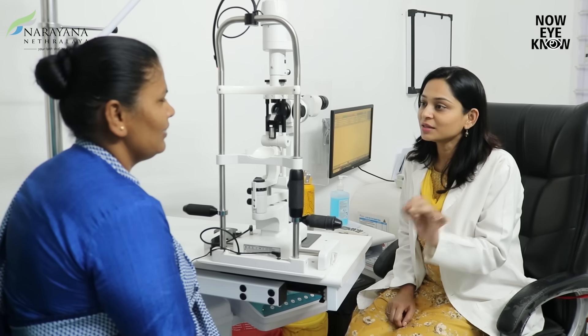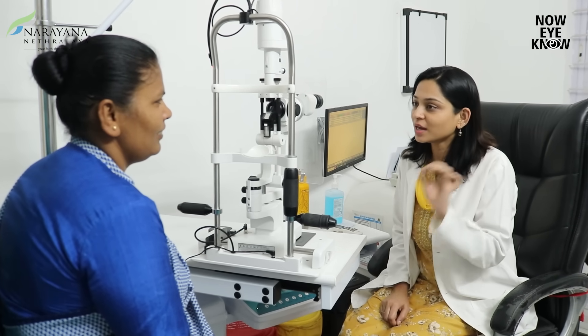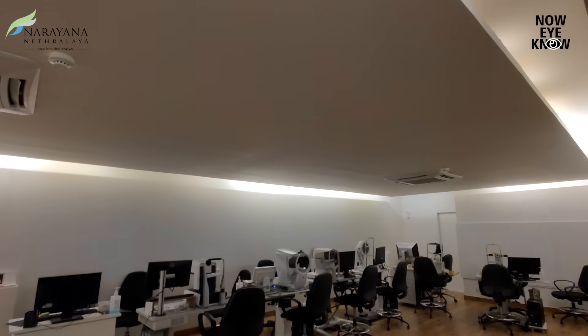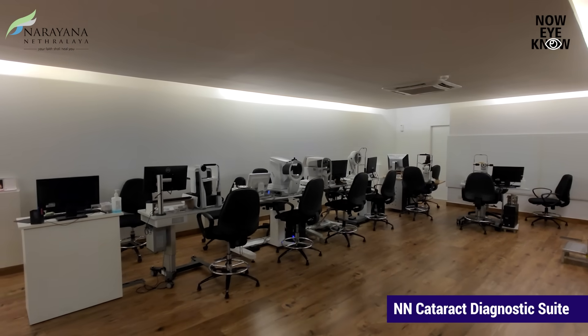We believe in giving you personalized care because every eye is unique and different. We do a comprehensive assessment of the entire eye to make sure we give you a perfect post-operative visual recovery. We have a dedicated room here — our NN Diagnostics — where we have the latest machines available, which help us in customizing the IOL power for each individual.